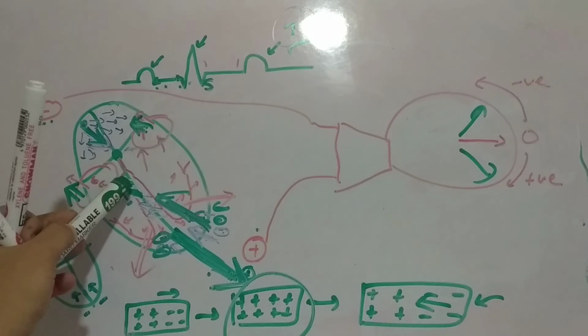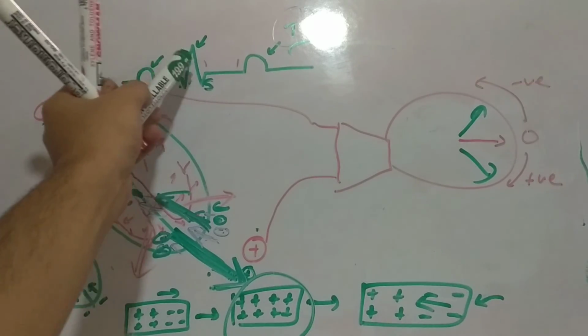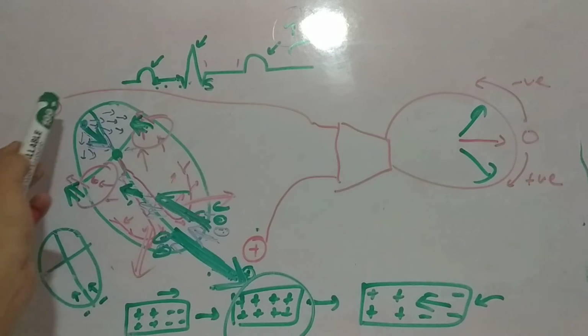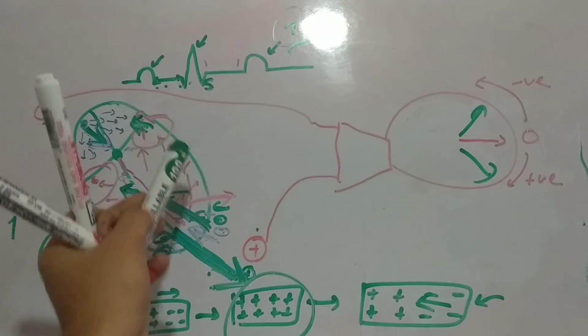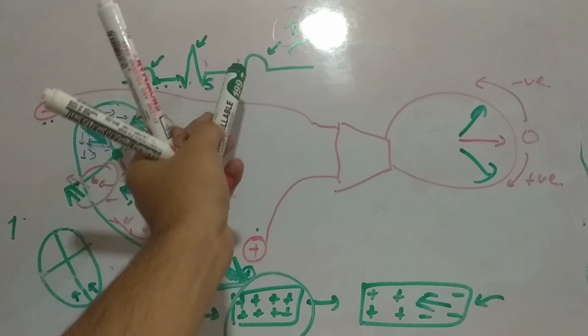And because of the Purkinje fibers the electrical transmission is rapid, so you can see the spike wave. The S wave is the representation of the ventricular depolarization of this part, where the positive vector is moving towards the negative electrode, so the deflection will be negative. The ST segment is the representation of full ventricular depolarization, so there will be no electrical activity, and the ST segment will be an isoelectric line.